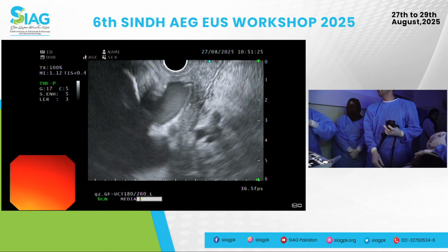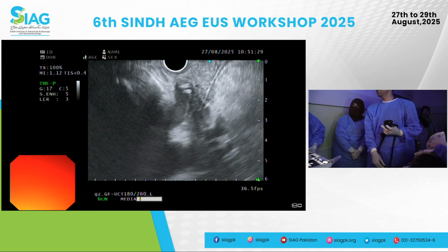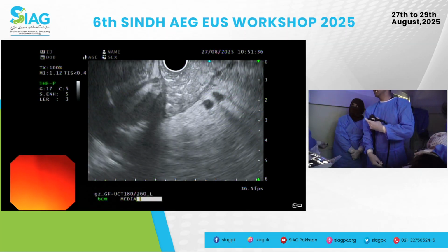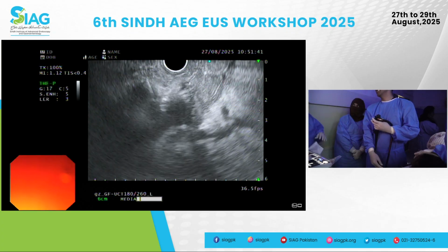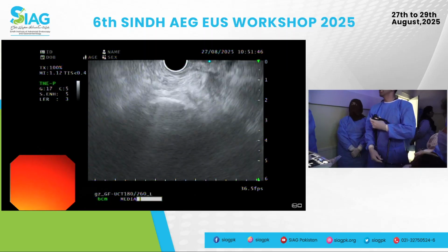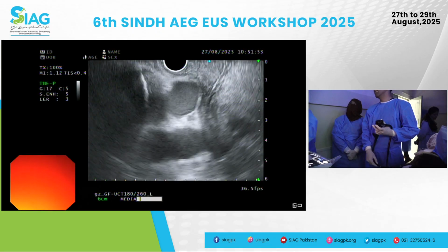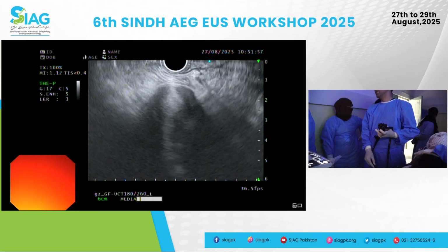Good, thank you. That's much better. Okay, so slowly withdrawing, withdrawing, withdrawing. We're just focusing. I think we've fallen back in again. It's fine. It just happened. That's absolutely fine. See, slowly withdraw. That's always a possibility.